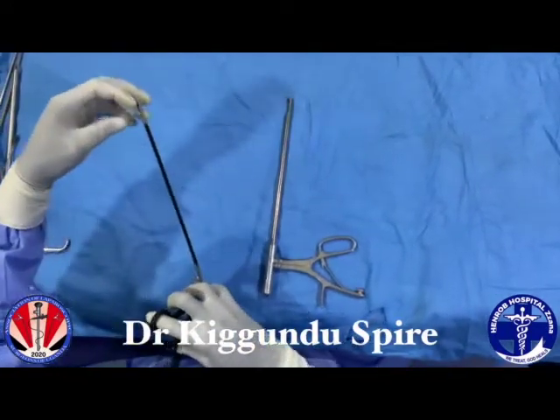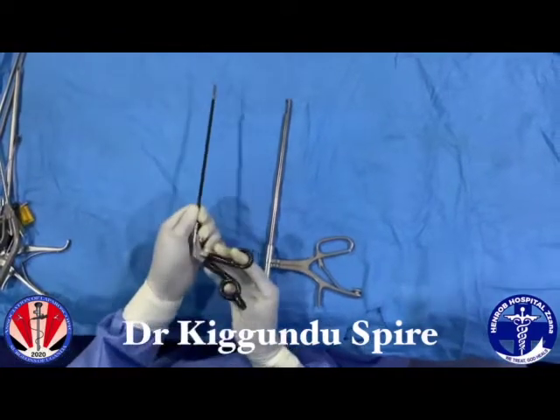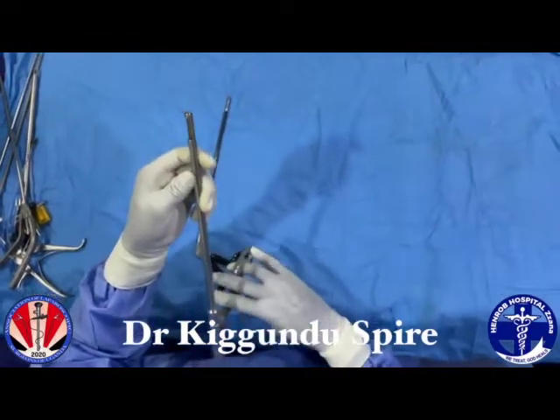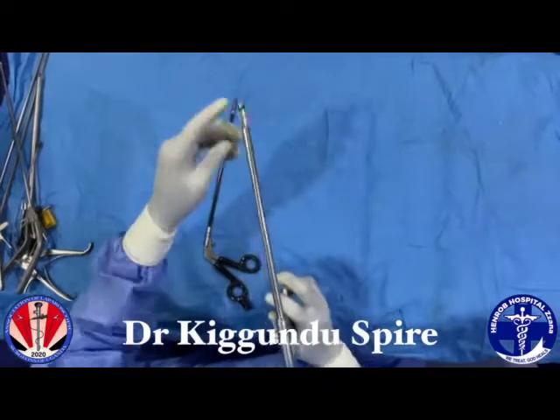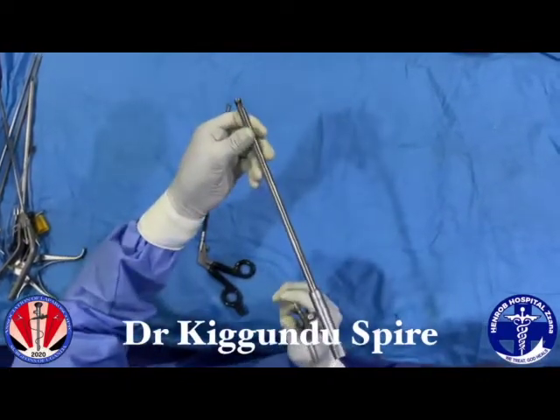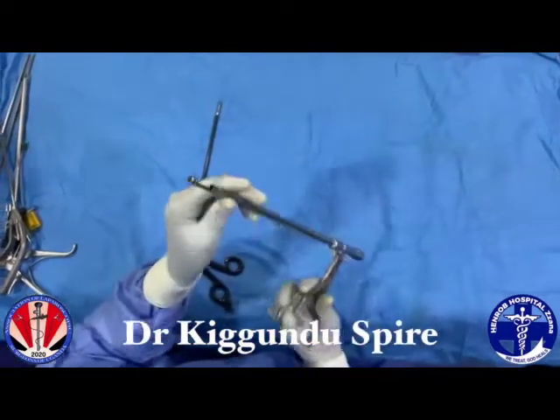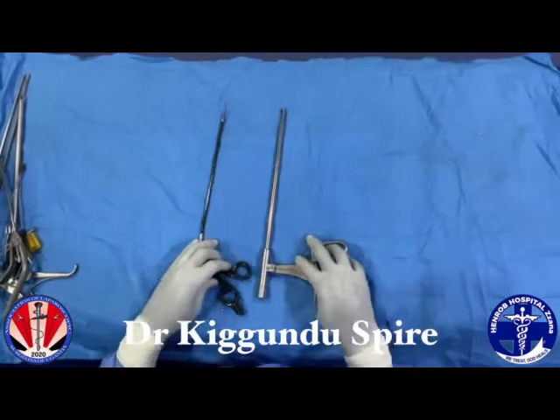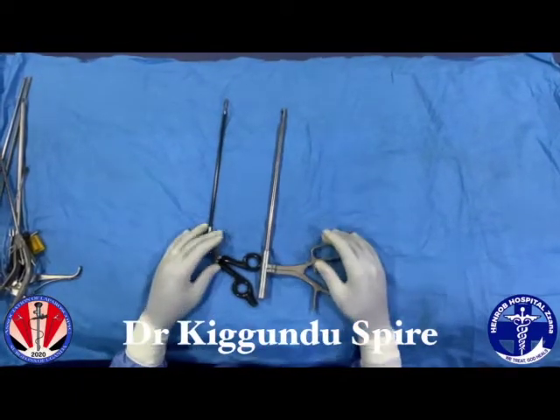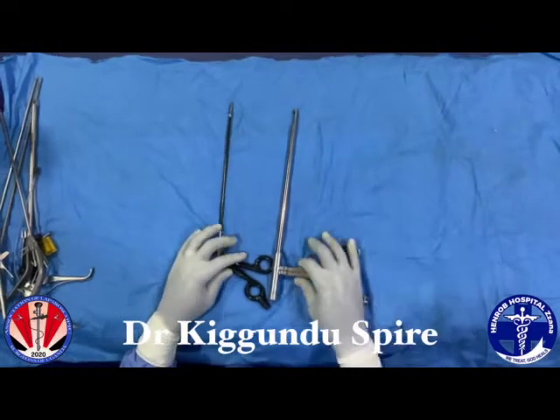You get it to your target and can easily take a small punch on the tissue. The same applies to this instrument — it has a different mechanism, but when you have a larger tissue to biopsy, it comes in between and you can take a punch and send it for histology. These are basically simple instruments for punch biopsies, either during a diagnostic laparoscopy or during an interventional surgery.